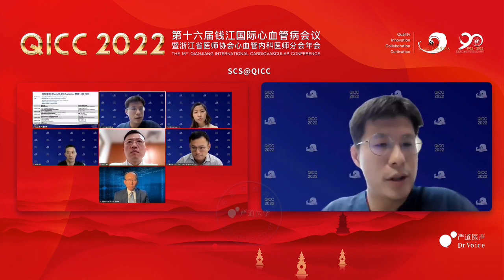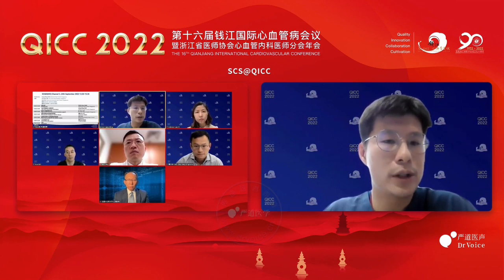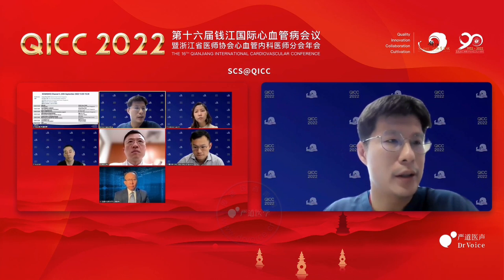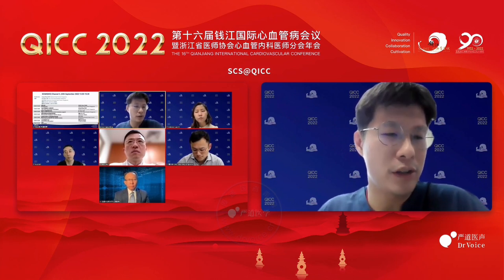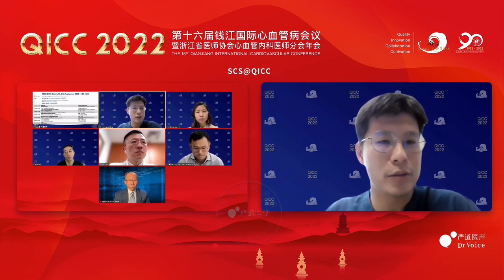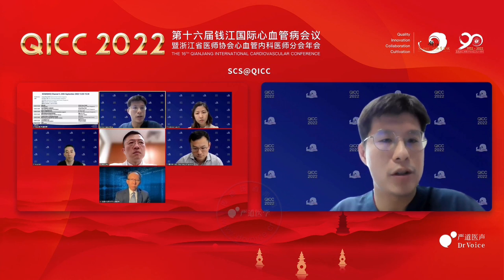Well, I think it's a good question, Chiang. I do believe that the use of intracoronary imaging is actually critical in most cases, especially in regards to left main stenting. It provides really important information in regards to pre-procedural sizing, especially when in quite a few cases there may be no suitable proximal reference diameter to select. And as I illustrated with regards to the specific anatomy of the left main, quite frequently bifurcation stenting may be required. You may actually have to do a POT with a large oversized balloon. So it's actually pretty important that IVUS or OCT can guide us to the appropriate size of the balloon that's required without causing injury.